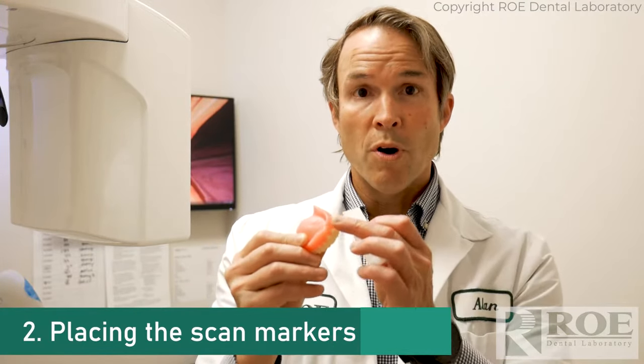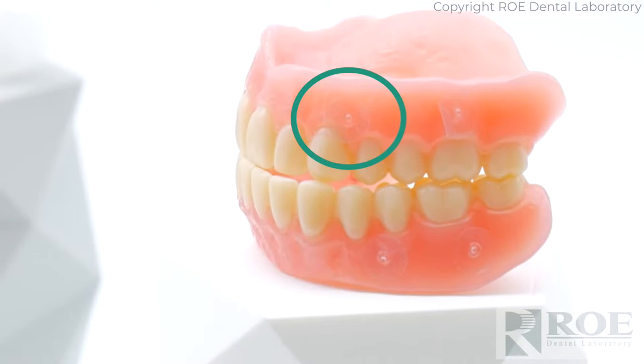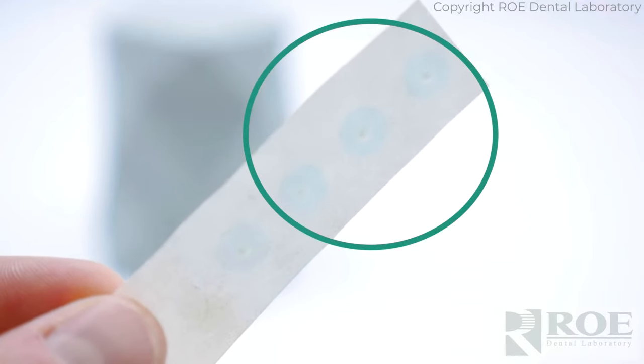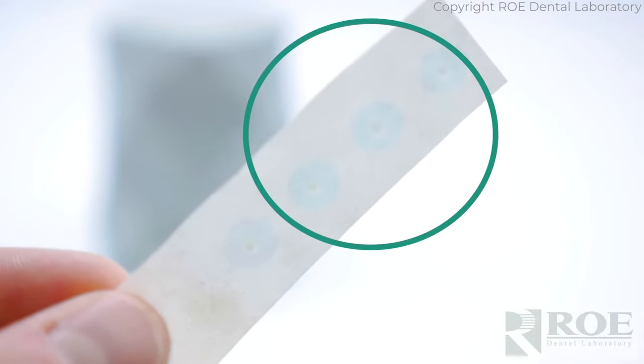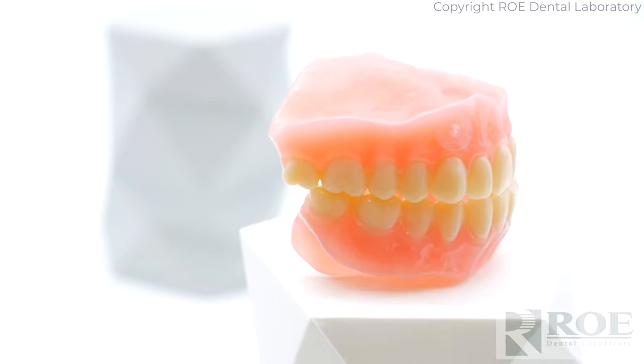Once your denture fits and has good occlusion, the next step is to put markers on it. With all dual scans, the scan appliance has to have markers — four to six, preferably six. You can use gutta percha: take a number eight round burr and bury it about a millimeter deep randomly in the pink acrylic. Or you can purchase Sure Marks from Sure Mark, or we sell them as well. They are clear, radiopaque markers that come on stickers. Peel the sticker off and place them randomly on the pink labial surface of the denture. You can put them on the tongue side if there isn't much flange, or even in the tissue area, but never on the intaglio — that will hold the denture up. Place six markers and your denture is ready to scan.